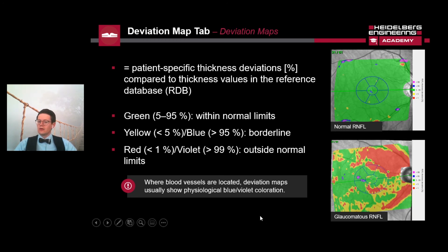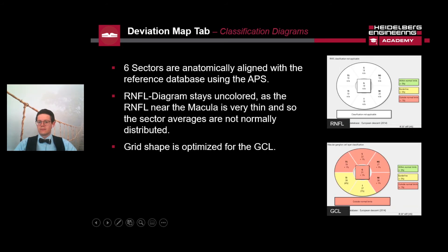Now let us see how it looks in the classification diagrams. The six-sector Garway-Heath grid is anatomically aligned with the reference database using the APS, and the results are displayed as a classification chart. The grid has been optimized for GCL thickness, so there is no RNFL color-coded classification chart. This is because the RNFL is anatomically thin in the macular region, which limits the reliability of measurements in this location, and because RNFL defects are typically most prominent beyond the confines of the GCL-optimized grid.